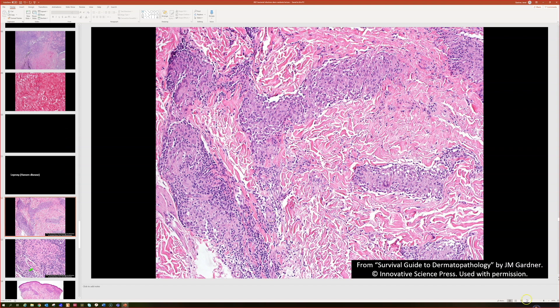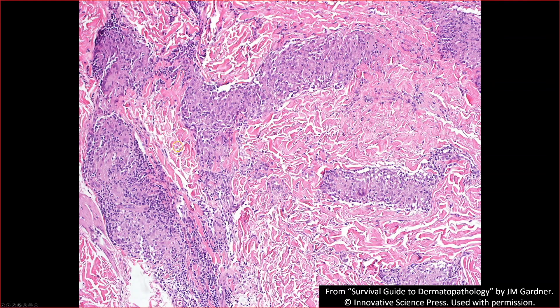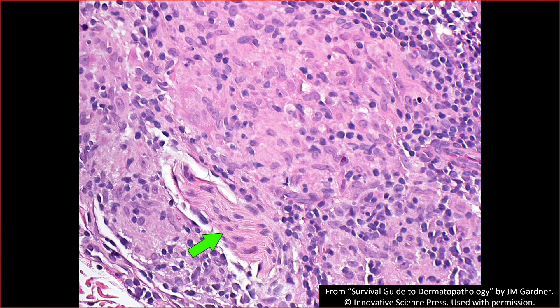Here's an example of tuberculoid leprosy where the granulomas are much more obvious. The cells are linear or serpentine because they're tracking along neural structures and around vessels, and they tend to have dense cytoplasm — less of that loose, fluffy cytoplasm you see in lepromatous leprosy. They're almost sarcoidal granulomas. There's a nerve right here with a sarcoidal granuloma wrapped around it.